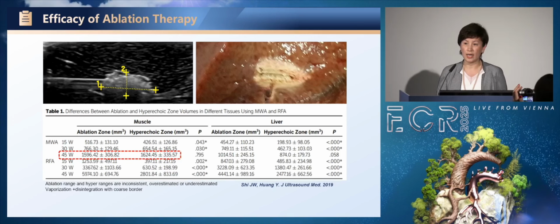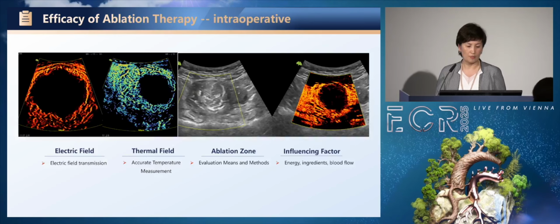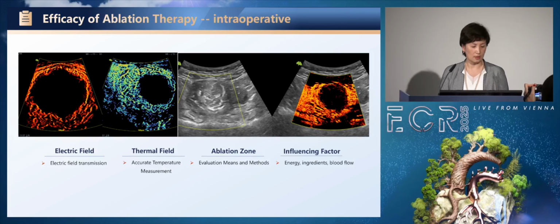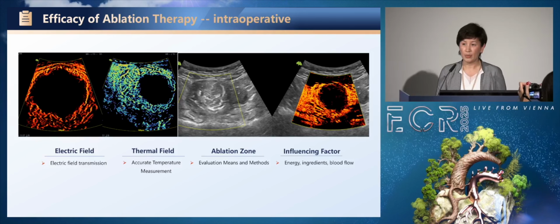Knowing the accurate border of the lesion is very important. So we want to use this method to see if we can get a clear display of the lesion, because during ablation, we cannot know the exact electric field, exact thermal field, and ablation zone. During the process, we know the bubbles, the gas, will influence the display.